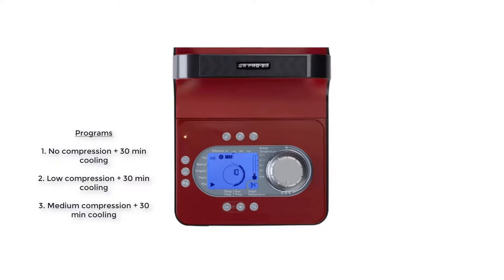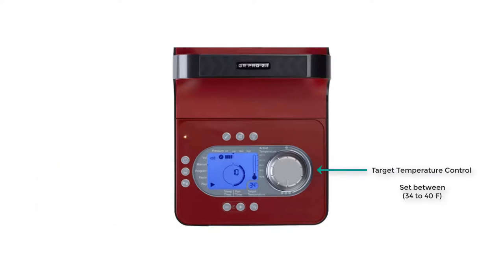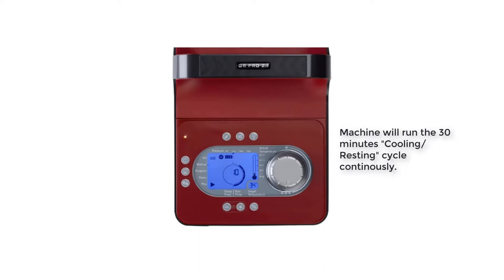Adjust the target temperature control and set it between 34 to 40 degrees Fahrenheit for best results. Press play and the machine will start running for 30 minutes. After 30 minutes, the machine will stop and rest for 30 minutes, then automatically turn on again.